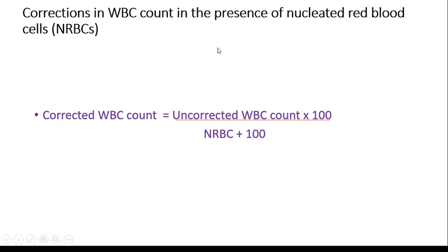Corrections in WBC count in the presence of nucleated red blood cells. When nucleated red blood cells are present, they will be included in the total WBC count. If they are present in significant numbers, the total nucleated cell count should be corrected to obtain the true total WBC count. Count 100 white cells and count all the NRBCs while counting those 100 white cells. The corrected WBC count equals uncorrected WBC count multiplied by 100 divided by NRBC plus 100.